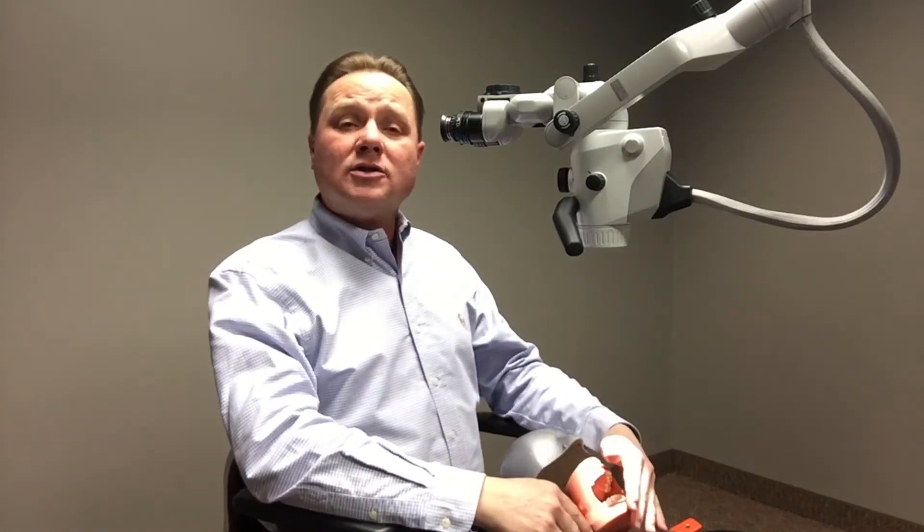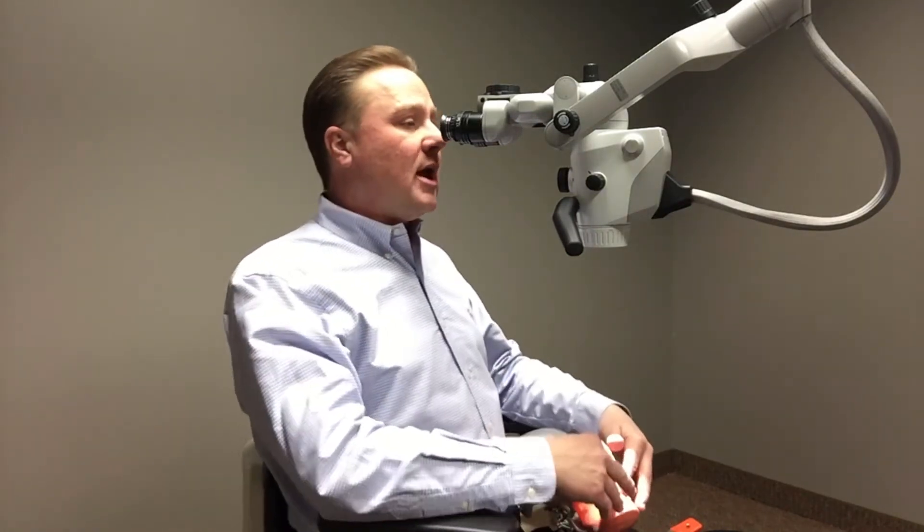First of all, we want to make sure that our eyes, our shoulders, and our forearms are parallel to the floor when we're looking through the binoculars.